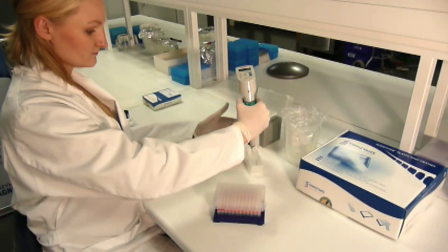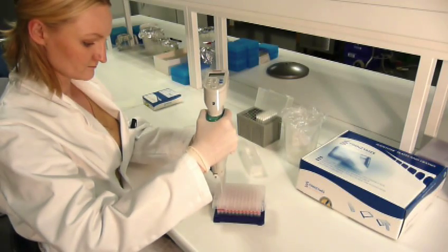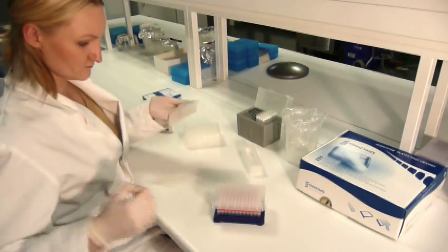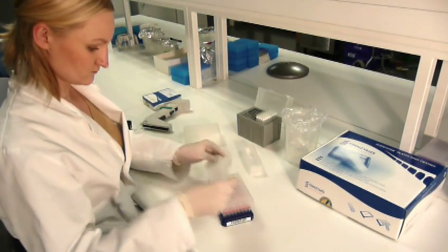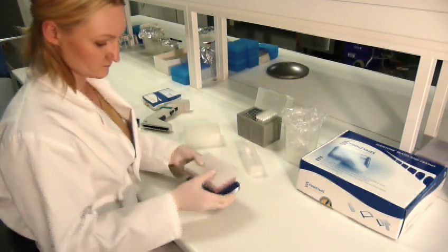The assay is equally sensitive for viable and growth-inhibited bacteria. Consequently, the Pathoproof Assay gives 40% fewer false-negative results because it avoids the problem of growth failure of inhibited cells, making it the most accurate mastitis test available.